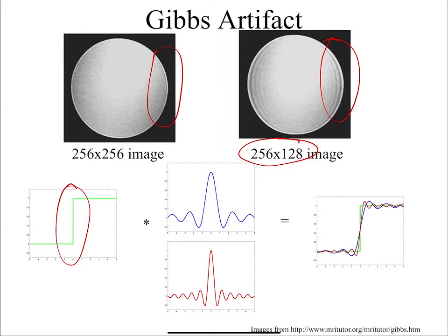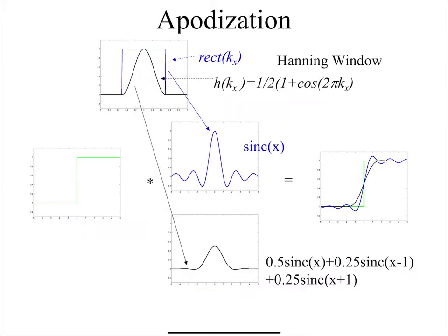The other option that happens a lot is what's called apodization. This is a theme that comes up over and over in medical imaging. You saw it in CT when you had the Ram-Lak filter, right? You had this thing that was going off to infinity and you just chopped it off. You'll see this if you take the course next quarter, BE280B, in ultrasound, where apodization is used all the time.